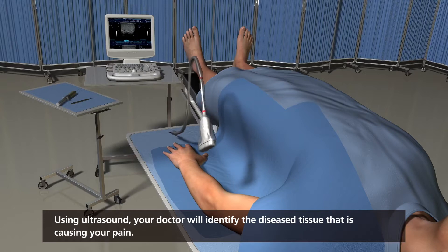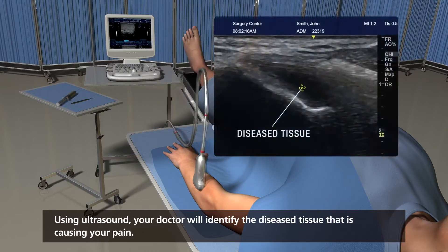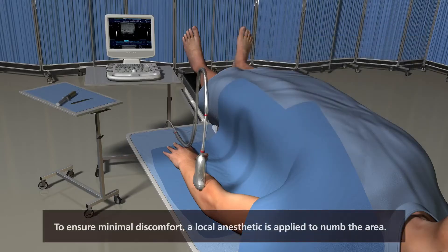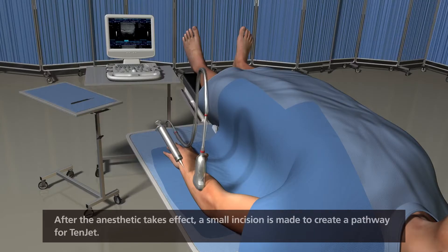Using ultrasound, your doctor will identify the diseased tissue that is causing your pain. To ensure minimal discomfort, a local anesthetic is applied to numb the area. After the anesthetic takes effect, a small incision is made to create a pathway for TENJET.